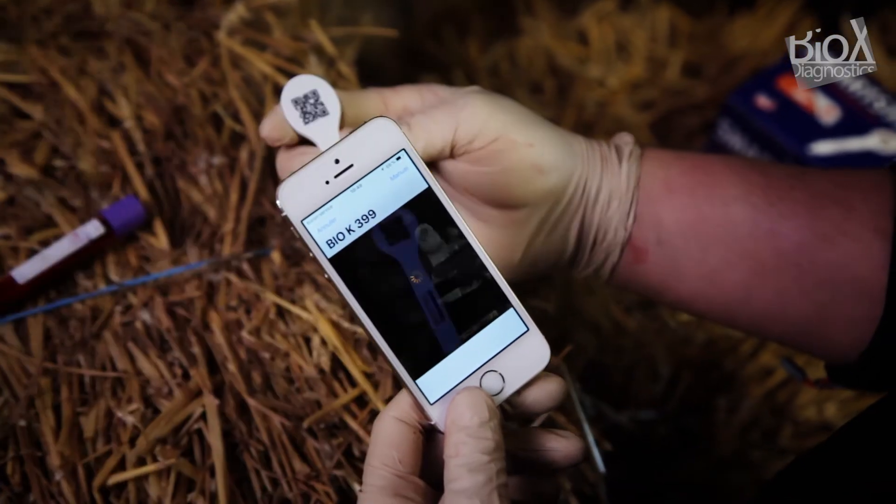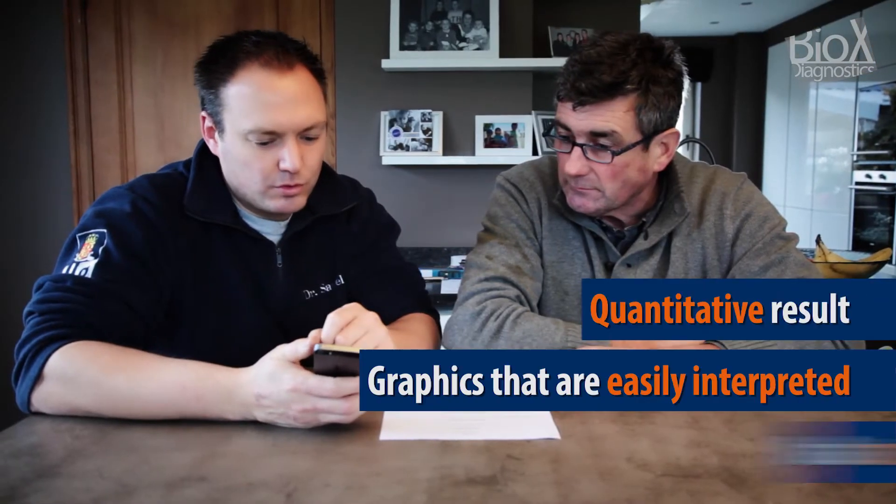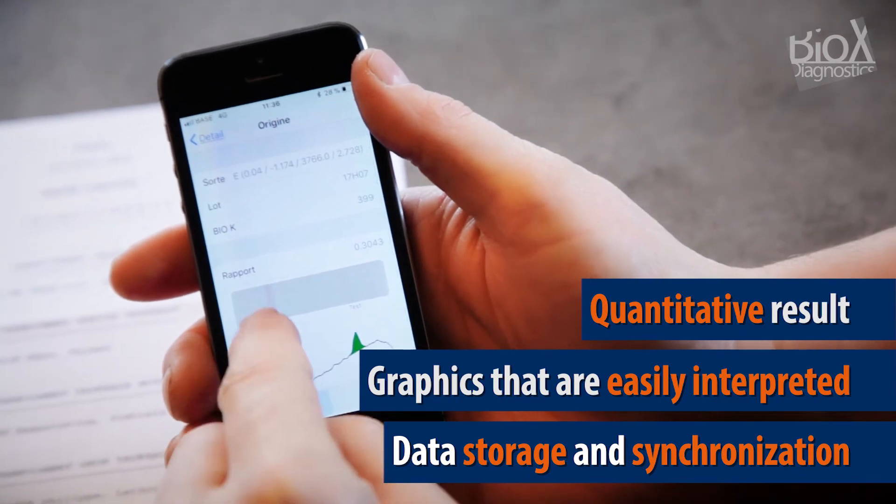Simply download the SmartStrips app. And SmartStrips does not just give positive or negative results — it goes well beyond that. It provides quantitative data that can be saved and synchronised with a computer or a remote server.